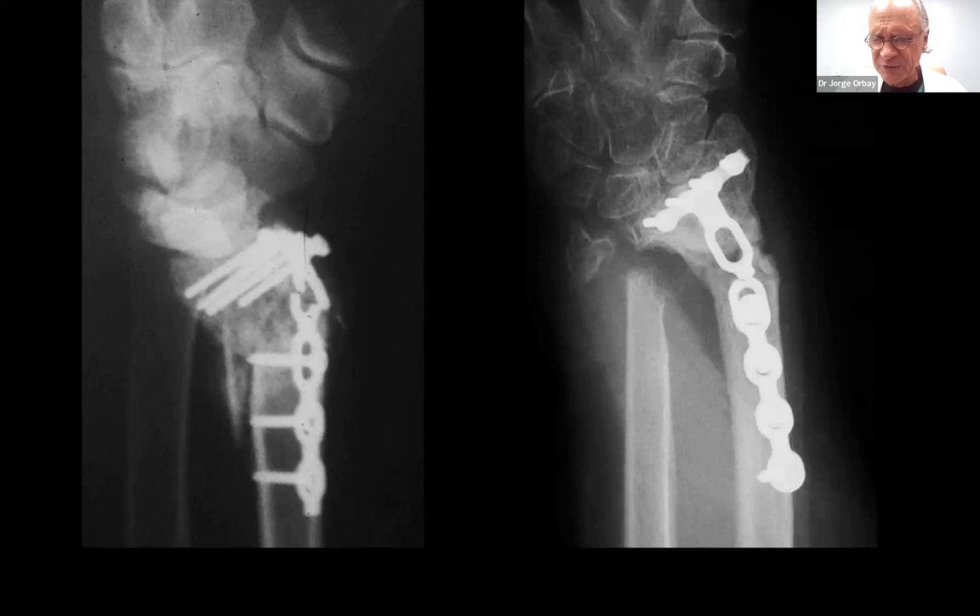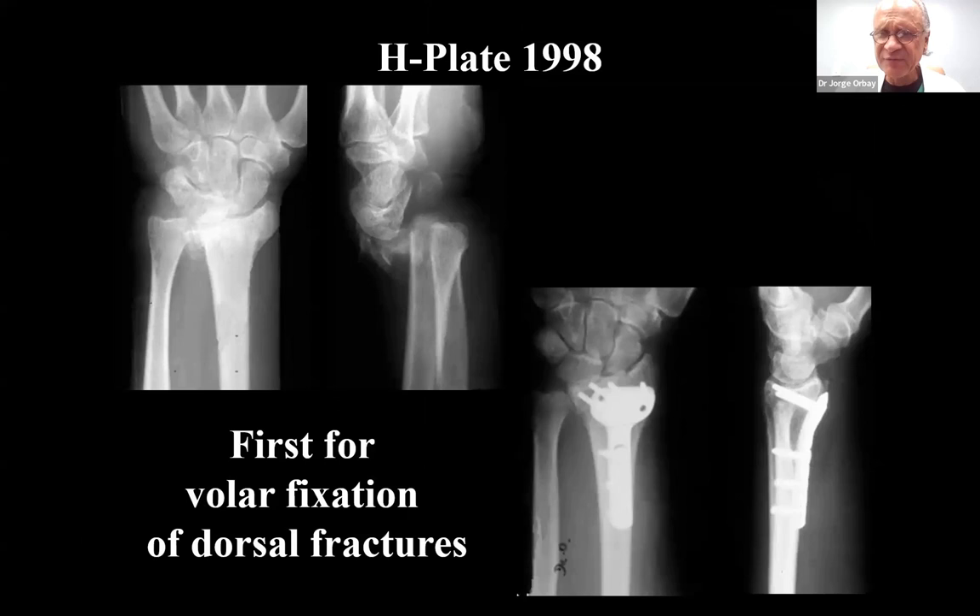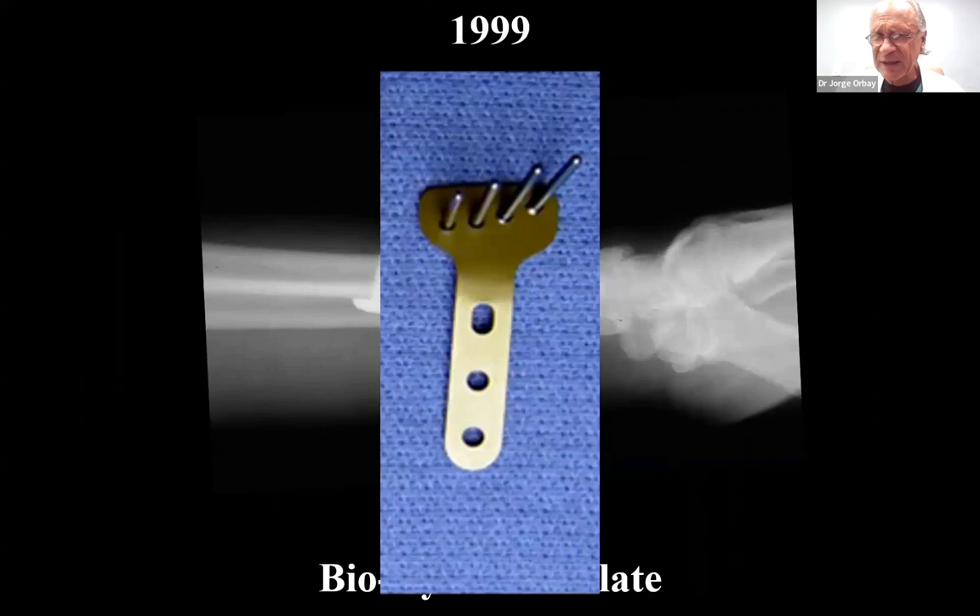Unfortunately, this plate was poorly designed — it wasn't designed to fix the fractures from the volar side, it had a lot of problems, and we had to cast the fractures. So my group decided to improve these volar plates. We designed our first volar plate designed for dorsal fractures — we called it the H plate. There was only one plate that should fit every human being: if you had a right-sided fracture you used these four holes, if left-sided you would use those four holes, trying to maintain that tangential support of the articular surface. Terrible plate. Very soon afterwards we decided, okay, let's make right and left plates — that fit better. And that was the biodynamics plate.